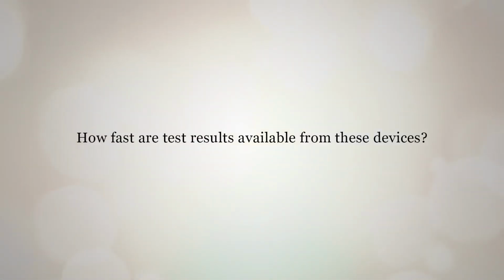You can imagine if a swab is collected in a remote site, say in northern Alberta, there's a transport time element to that, right? And so that may add on a day or several days to the test turnaround time. So if you can get the testing closer to where the samples are taken, that's going to improve your turnaround time for those local tests and provide more local capacity for the testing that's required. The expectation and how we're going to roll this out, it would be same day.